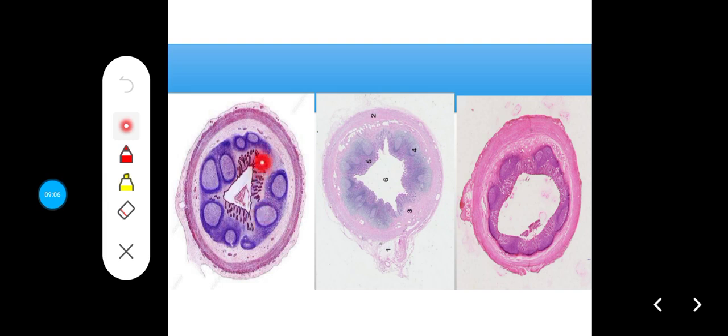So you just see the epithelium, which is the simple columnar epithelium, and then in the submucosa, you will now find the lymphoid follicles. You can appreciate that. So it's very prominent here. Look at this. Remember, lymphoid follicles stain more than other structures. They stain deep purple because of the presence of the granules and their nuclei.